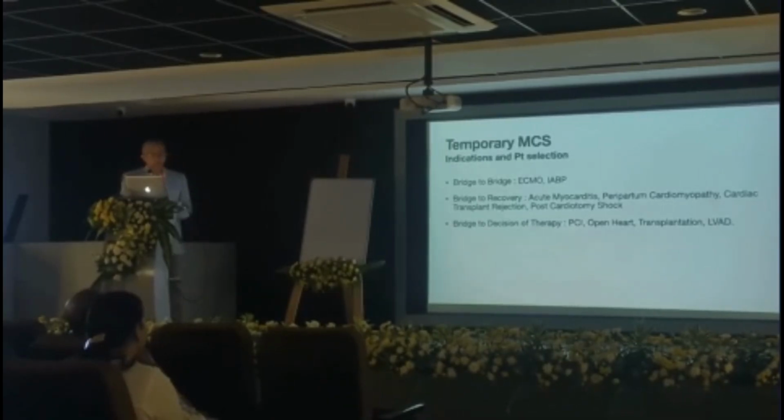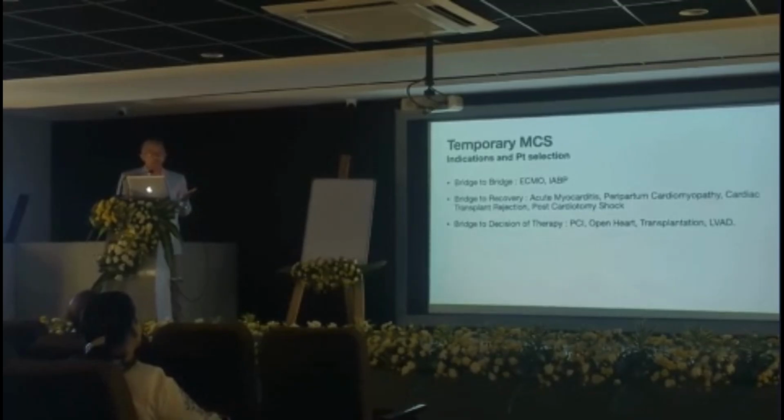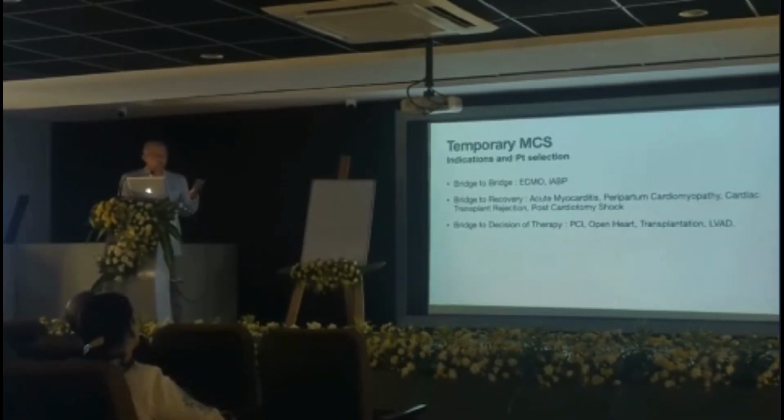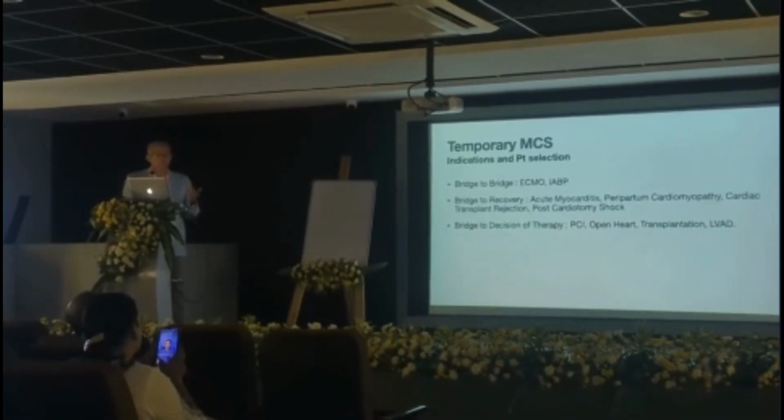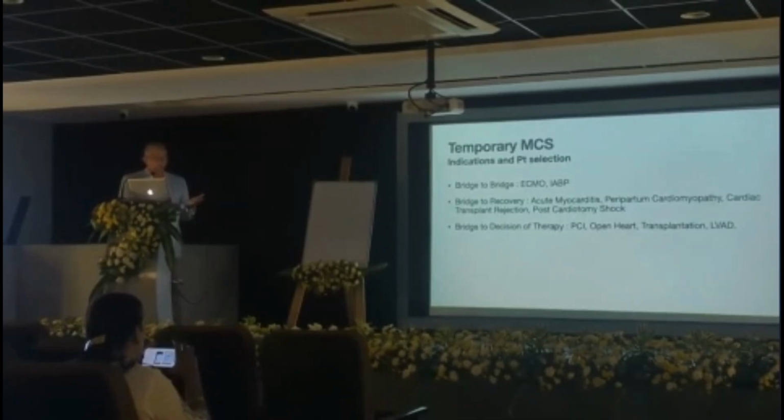Then coming to the different criteria in which we want to put this mechanical circulatory support. Once you are putting a mechanical circulatory support, you should always know what the exit strategy is. That is the first important thing.